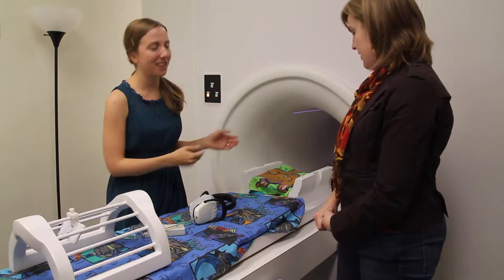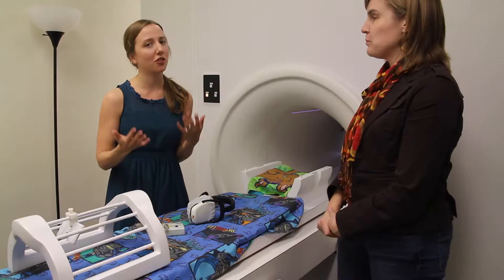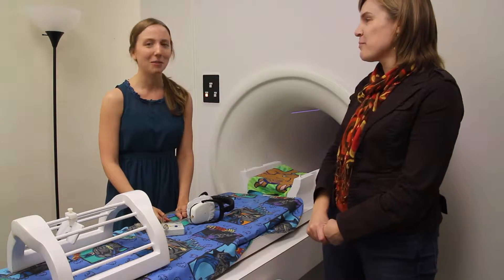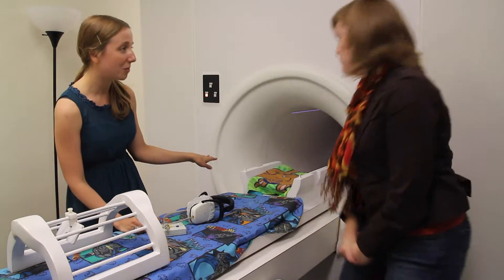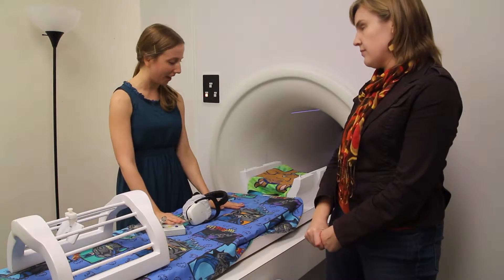This is our pretend MRI scanner, and Sarah's going to go in today so that she has a chance to practice what real MRI is like — to make sure that she likes it before she shows up for her actual MRI appointment, because they are expensive. Sarah, what you see here is this is the tunnel. It's kind of like a tube slide at the playground, and in a couple minutes I'm going to have you lay down on this bed.